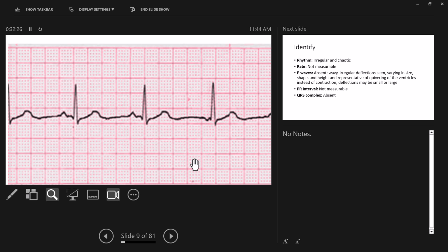So now, say it again, Sydney. So remember, okay. So up here is the SA node. I think I heard you right. AV node is down here. The normal conduction pathway of the heart is to go this way. When it's going down towards this lead, that gives us a positive deflection of our P wave.